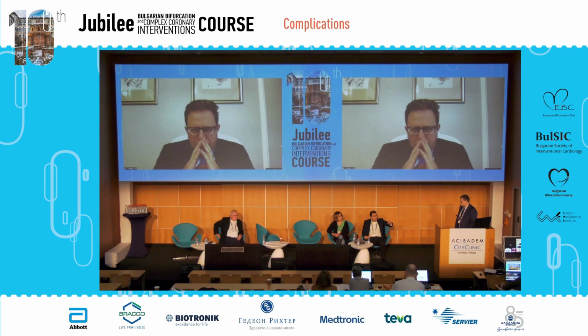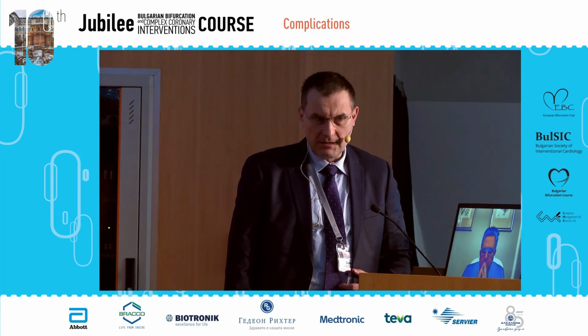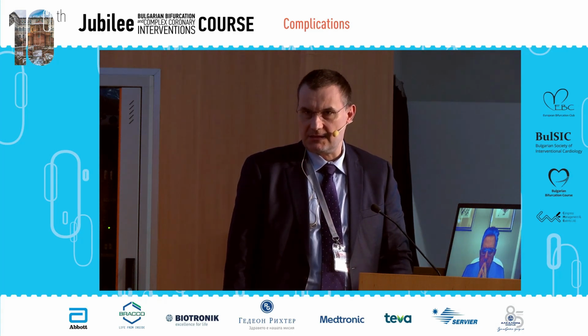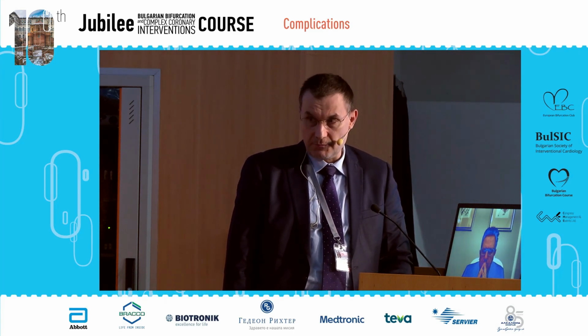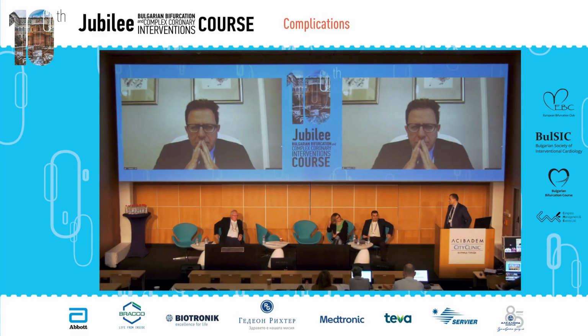And the balloon proximally is according to the proximal main vessel. Yes, okay. The balloon size in the main vessel is according to the proximal, like in POT, the same. Okay, we will see. Thank you.